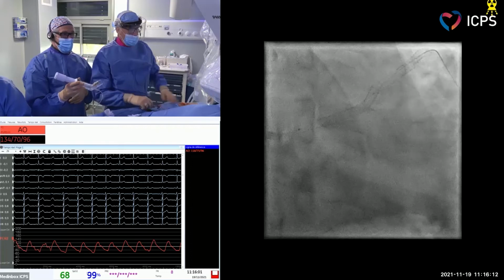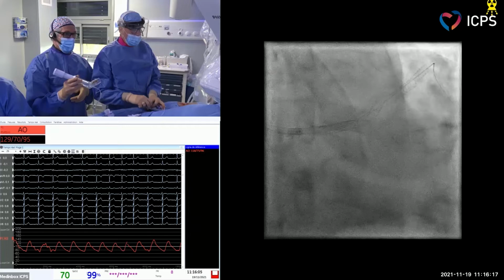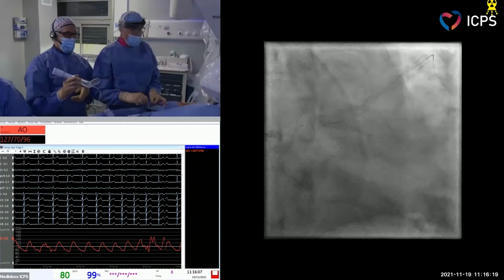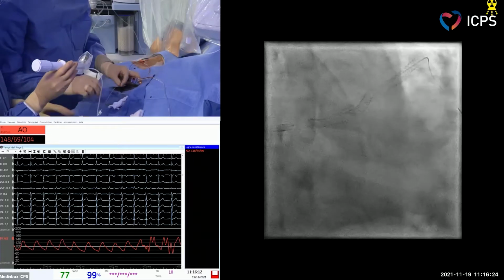Okay, so I need a little bit more support. Very careful not to go against the... Is it the good wire? I will check.